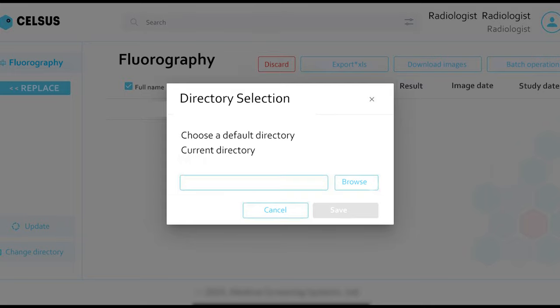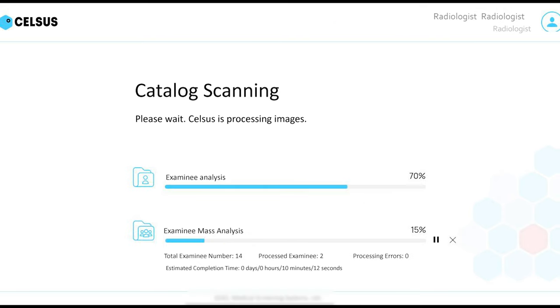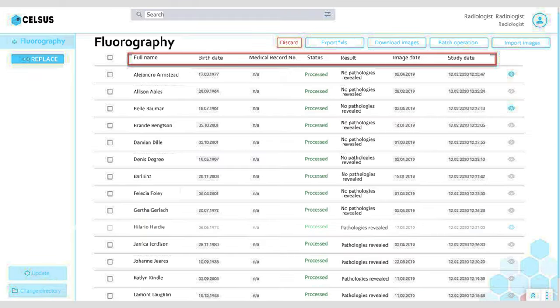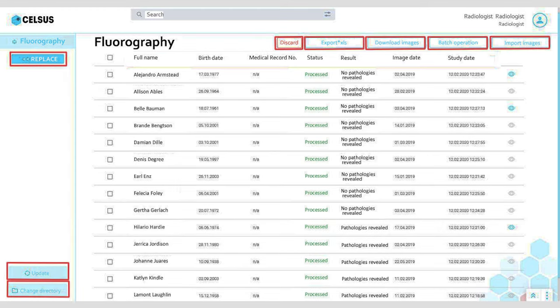After selecting the directory, we can process the studies individually or run batch processing. You can see the results of the analysis of some studies on lists and patients on the screen. It is worth noting that the system performs triage of patients, which helps to form an optimal screening scenario. Now you can see the results of the processed studies on the screen.